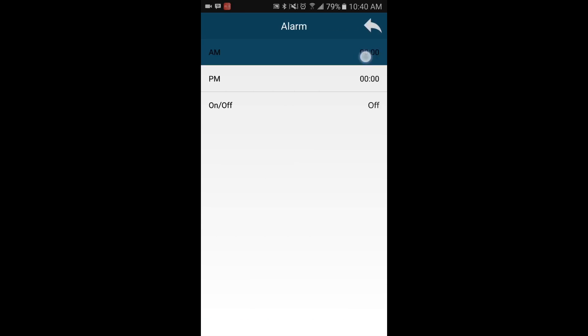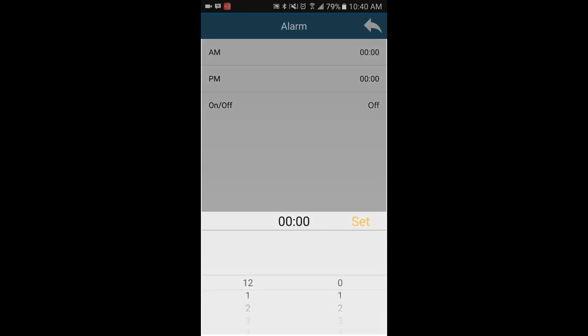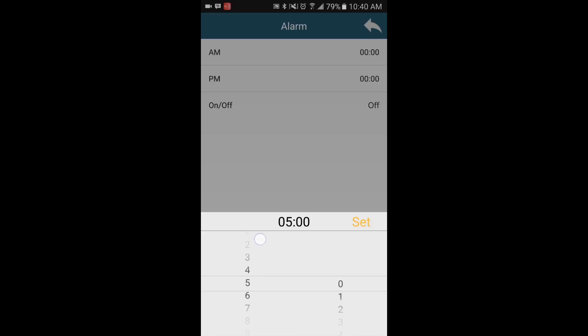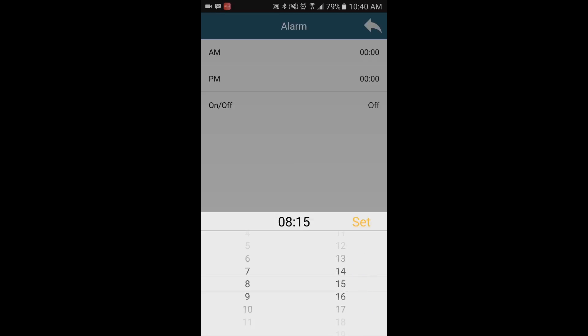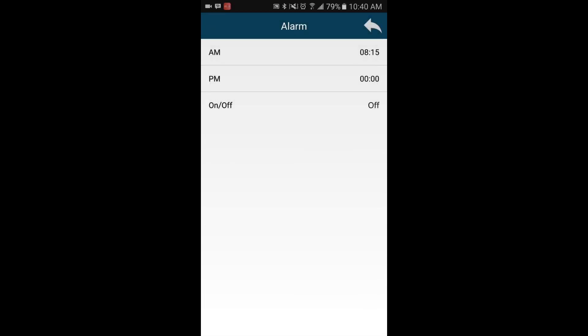You can now select the desired time for your alarms. Once your times have been selected, switch the alarm from off to on.